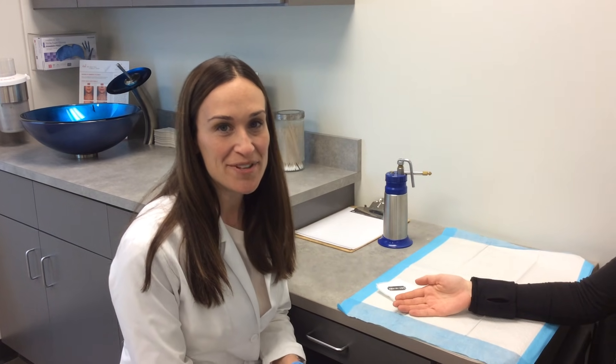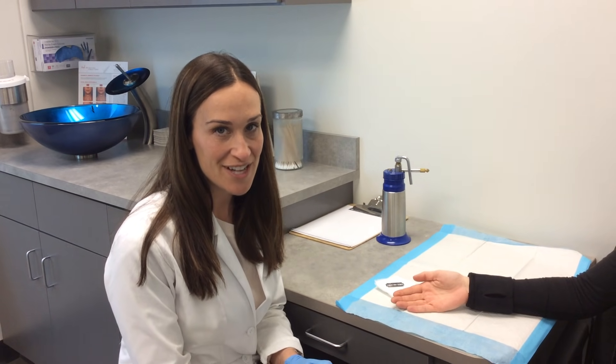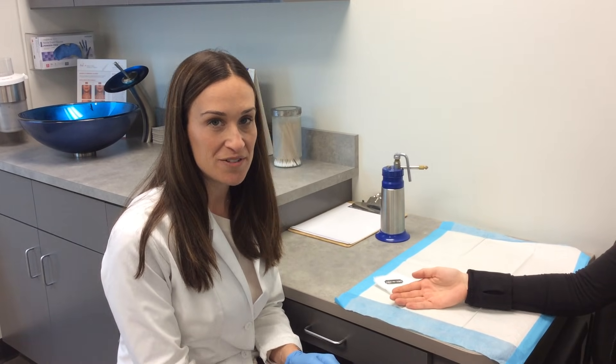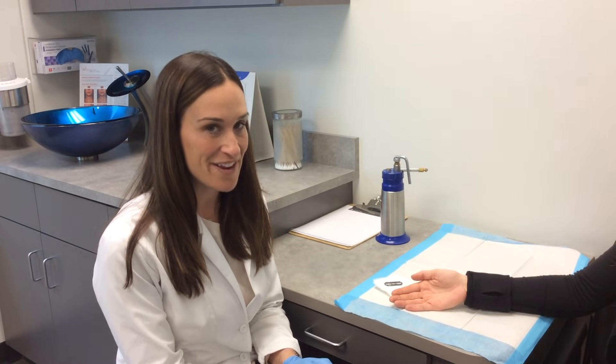Hi, my name is Lauren Sundick. I'm a physician assistant at Terrain Dermatology. Today I'm going to demonstrate a wart removal, something we do every day in the office. It's easy and not too painful.